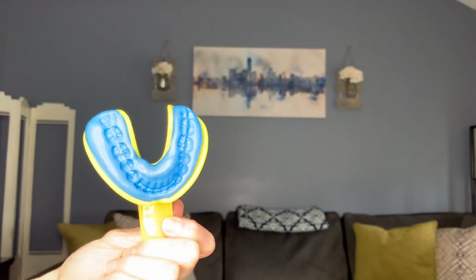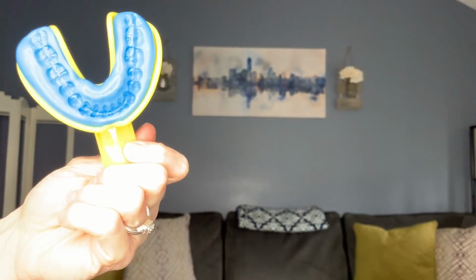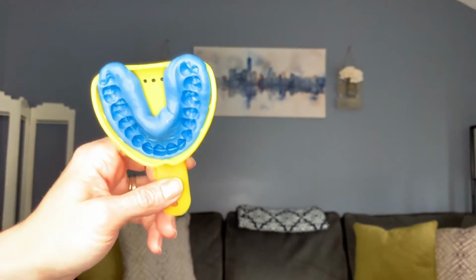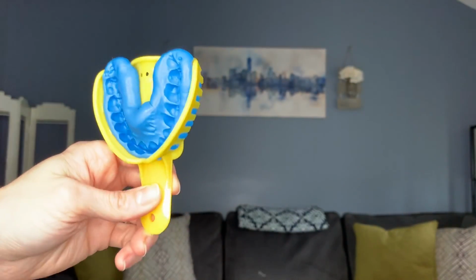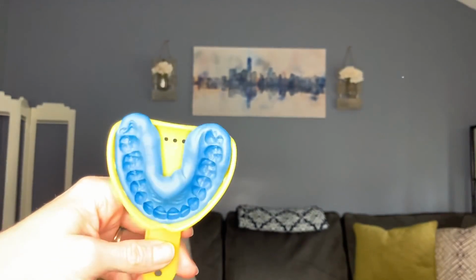Now, the second time that they sent me my kit, I still didn't do it right. This time around, I didn't put enough pressure. So I was thinking, okay, the first time I put too much pressure, second time around, I'll just put a little less pressure. No. As you can see here, I did not get good impressions of my back teeth. I barely dented that putty with my back teeth, and they really need that gum line. And as you can see, not very much for the fronts, but I didn't puncture the putty, so that's a good thing. On the fronts, it was almost perfect. Almost perfect, but again, I needed that gum line and I just didn't have enough of that showing.